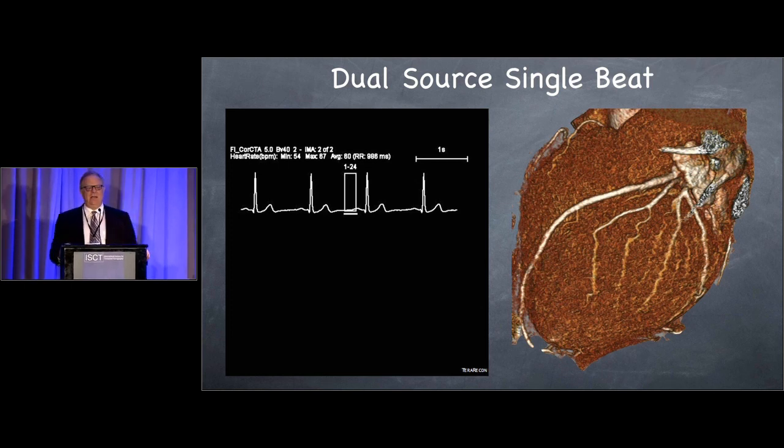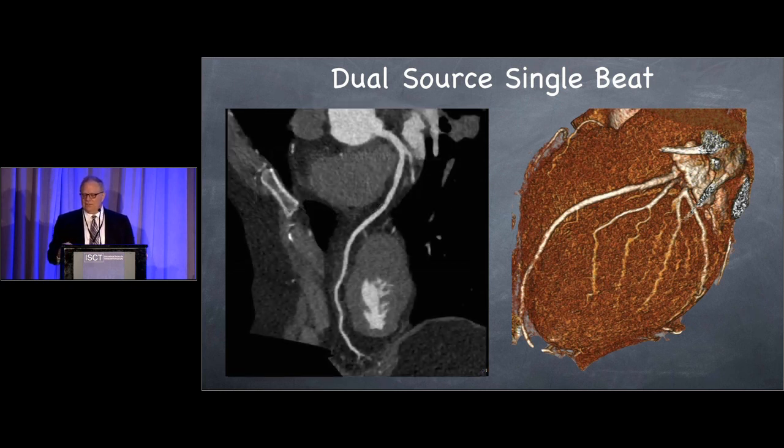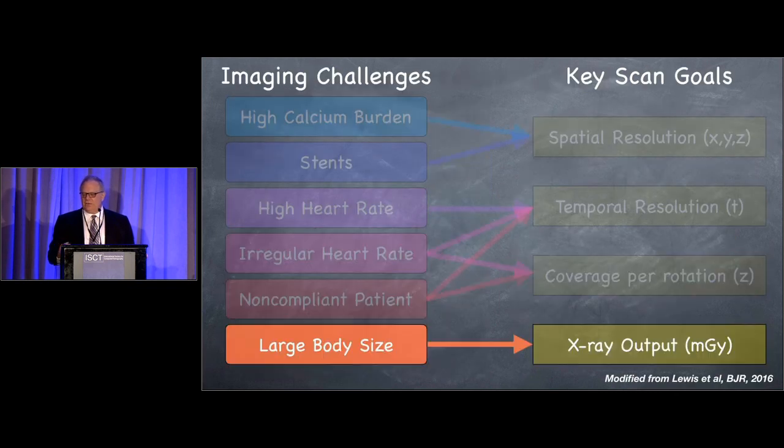Here you see a high pitch dual source single beat scan on your right. And excellent demonstration here of the left anterior descending coronary artery.